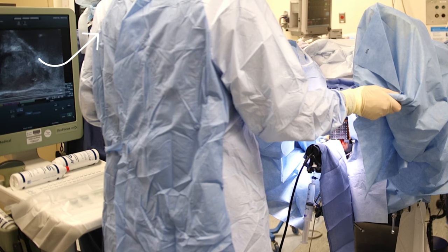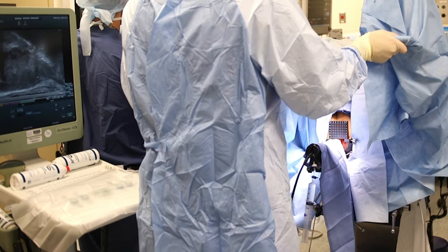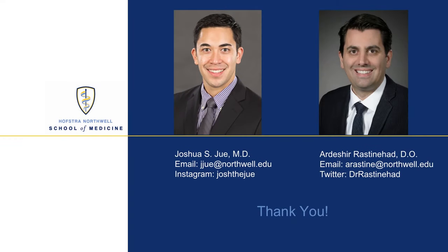Lastly, the patient's legs can be further raised to move the pubic bone away from the prostate. This is especially helpful for anterior lesions. This concludes our video presentation. Thank you for your time and feel free to contact us with any questions.